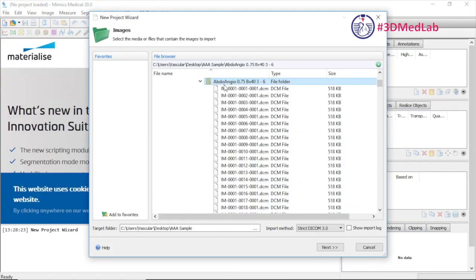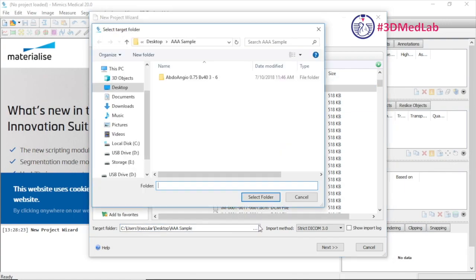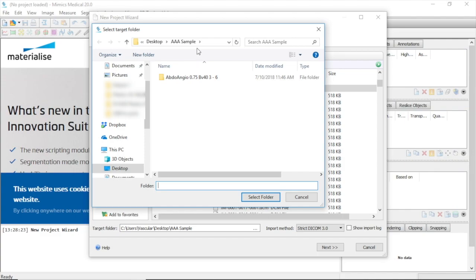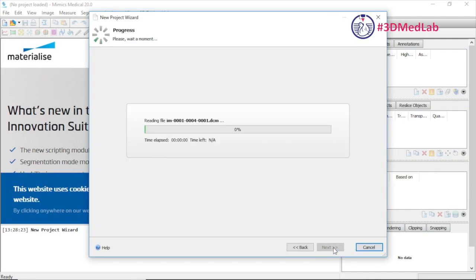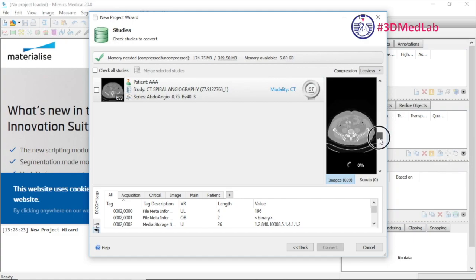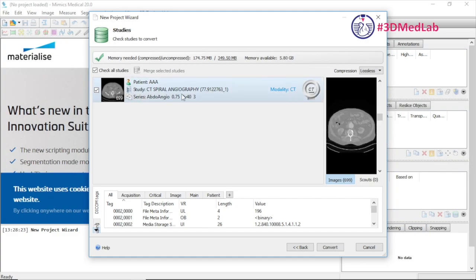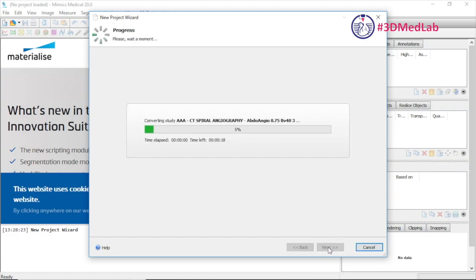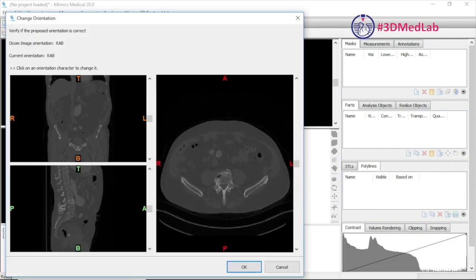If we start a new project we can then open up our DICOM dataset. Make sure we're in the right folder and click next to import — this can take a little while so we've sped it up. Materialise is pretty fast at importing. Once you've got this, we generally uncheck all of the studies, make sure we've got the one we want, click only that one, and then import.